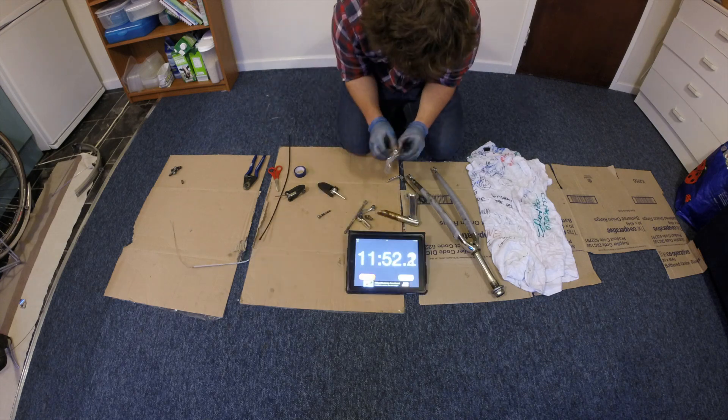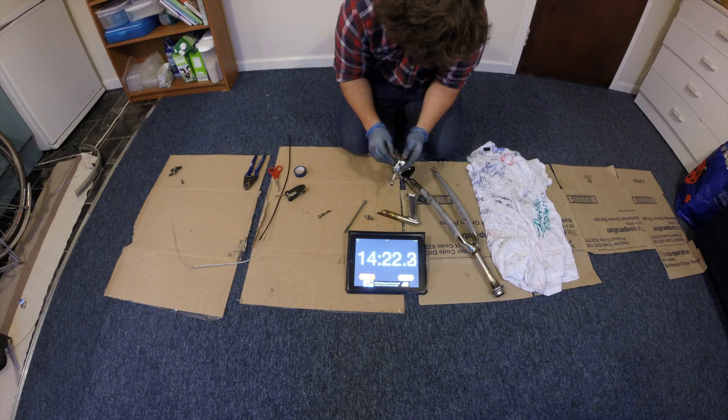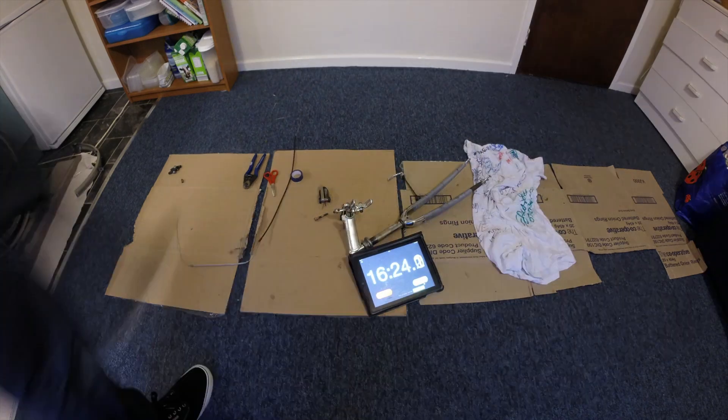Has it been done before? No — well, at least not that I know of. However, there are currently a few similar projects in existence. A prosthetic leg, finger and wheelchair have all been made from bike parts in the past.